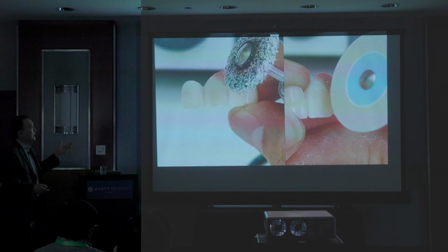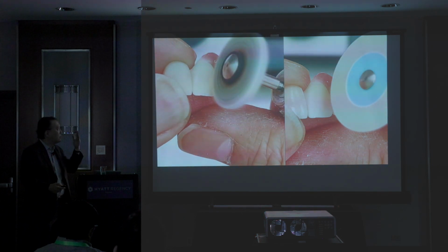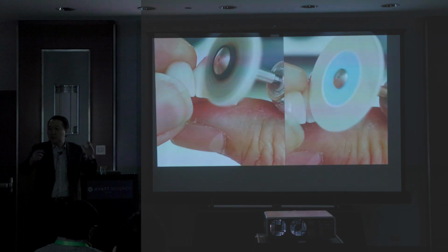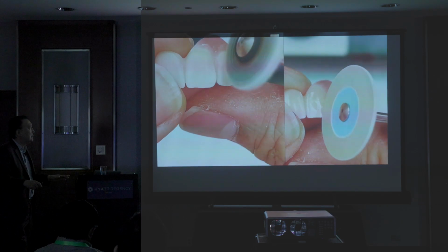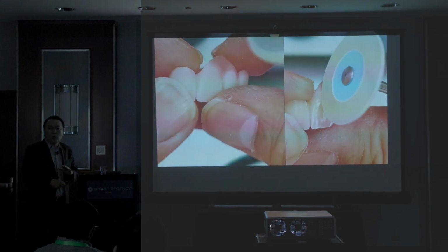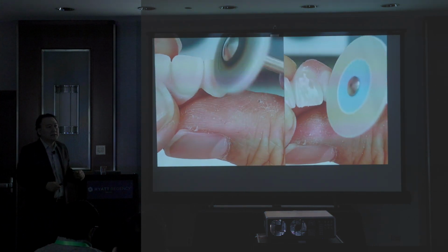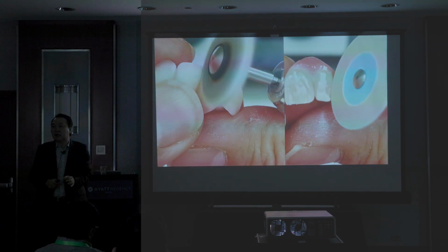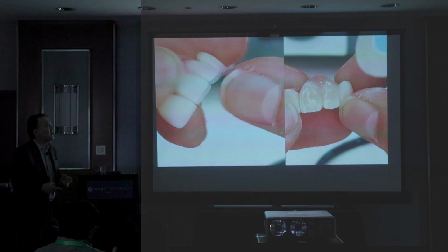And like I said, surface texture, if you think it's too much, use the Horico and then paste it and then just make whatever I want to approach it for the shining. Right? Low speed, you can use that one. You can do so many things with the ceramic before glazing. After glazing, it's kind of too late. After you put it in, whoever gives you the luster paste, whatever stain kit, you apply that one, it's too late, because too much is not good.